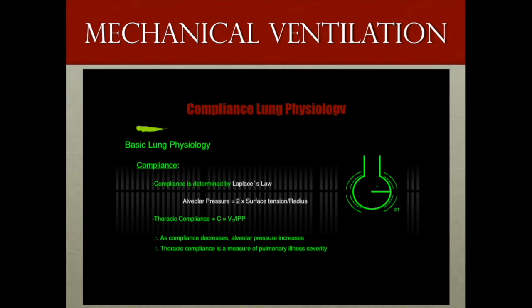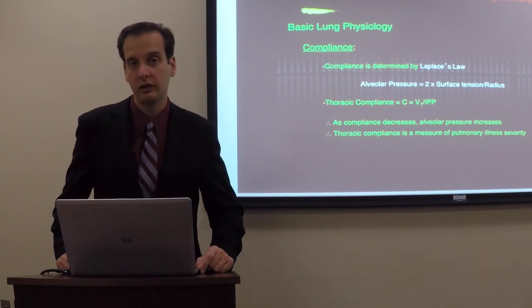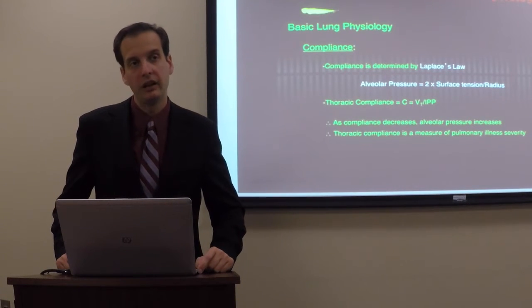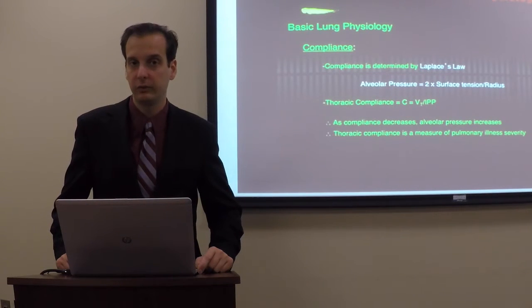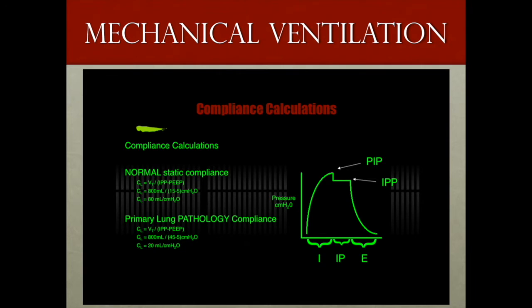So in the example of a patient who has a pneumonia and has an identifiable consolidation on their chest x-ray, antibiotics, nebulizers, and good pulmonary toilet are instituted, the patient will tend to improve prior to the radiologic consolidation resolving. A way to assess the patient's response to therapy is to look at the compliance of their lungs each day as they're on the ventilator. And with the resolution of the stiffness within the tissue as the pneumonia resolves, the lung compliance should improve, and this should be observed.